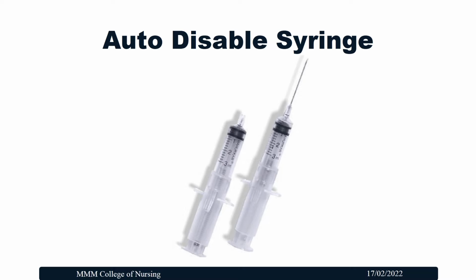This type of syringes are called as AD syringes or auto disabled syringes. It is very commonly used during the COVID vaccine administration. Once the injection has been administered, the needle will be withdrawn inside the barrel so that it cannot be reused anymore.